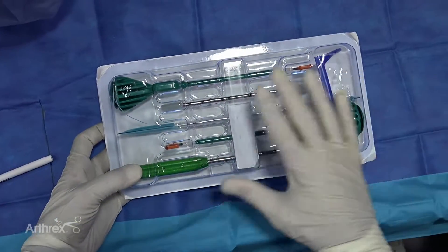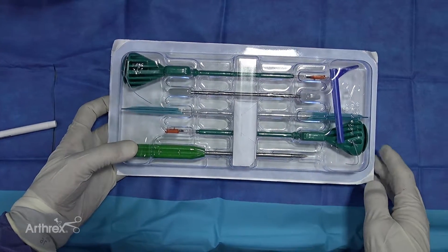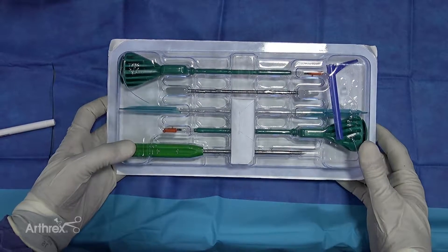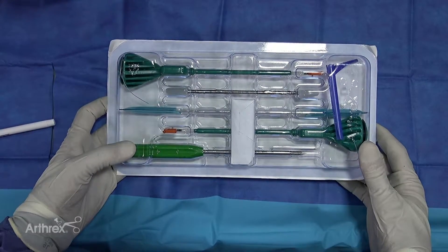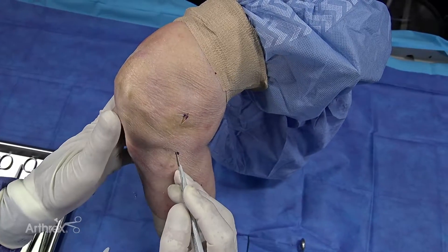This kit is self-contained. It has everything you need to do it, including the guide wires and the swivel locks and the taps. And most importantly, believe it or not, is the little blue shoehorn cannula. I'm going to make a small incision over the medial epicondyle.